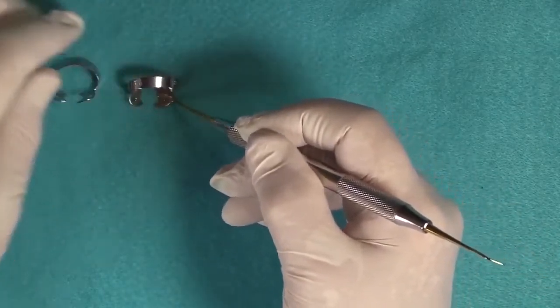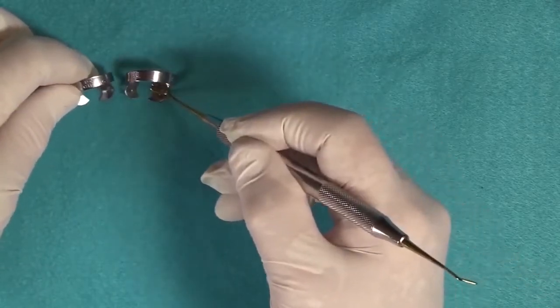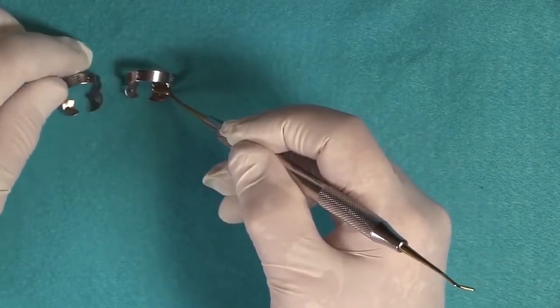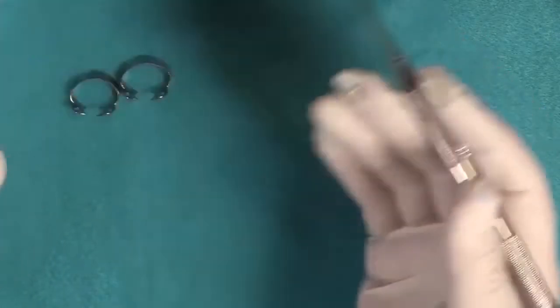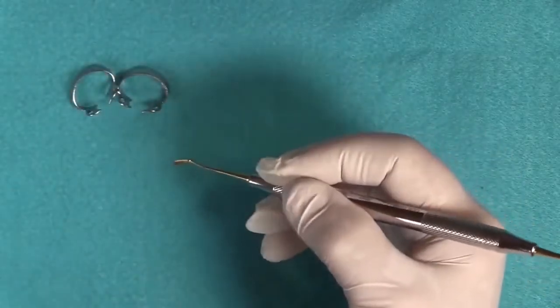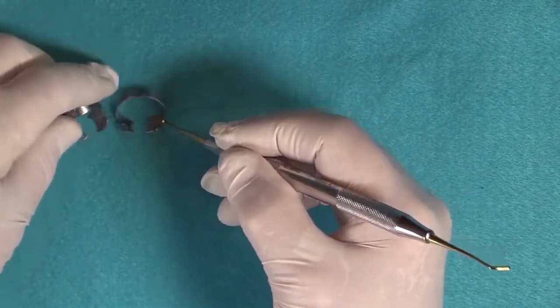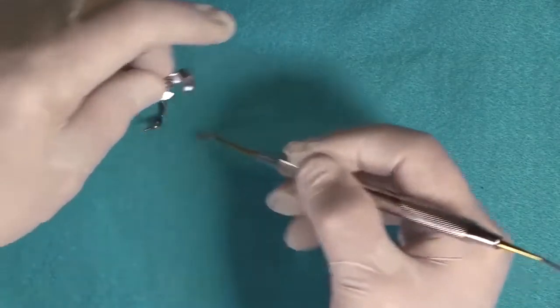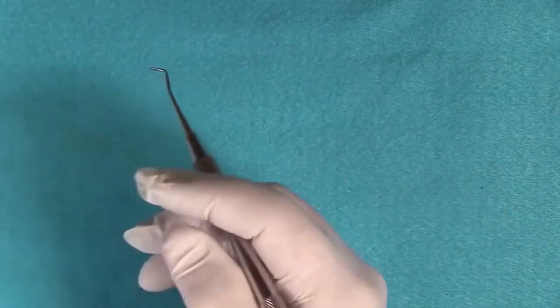But I also found that because these will stay on the deciduous and permanent first molars that come in, when you're doing sealants, they're not thoroughly erupted. These will stay on. So I usually use some topical at the gingival area, and then I'll use these clamps. Again, there's a right and a left, and they're a paired set. See that this side's bigger than this side. Anyway, these are specialty type clamps.